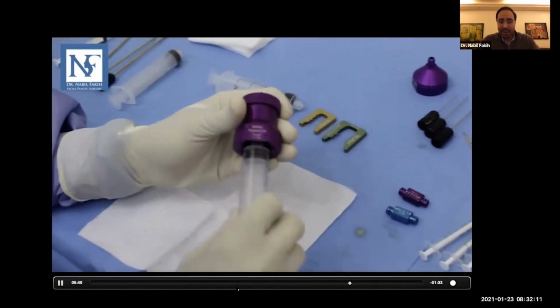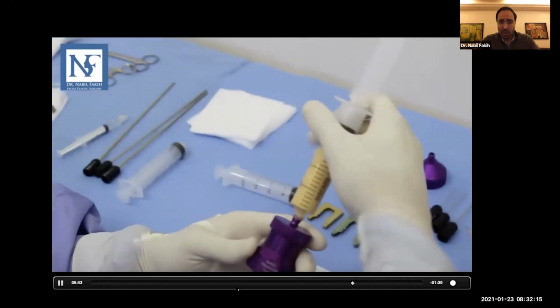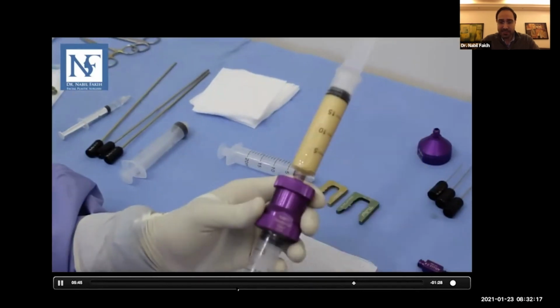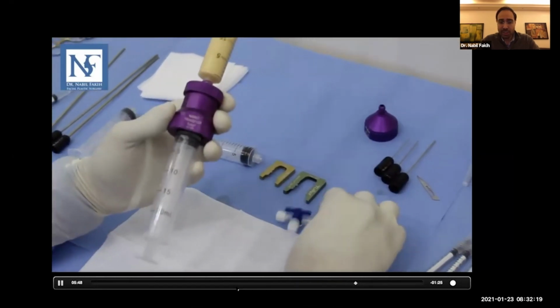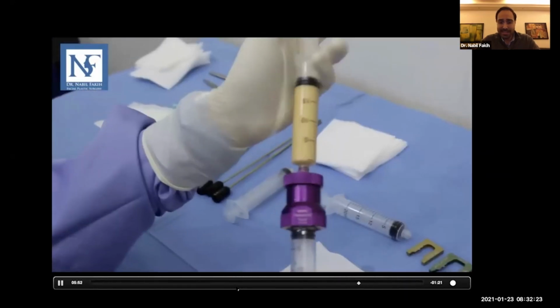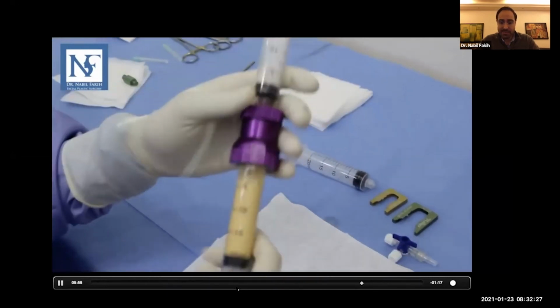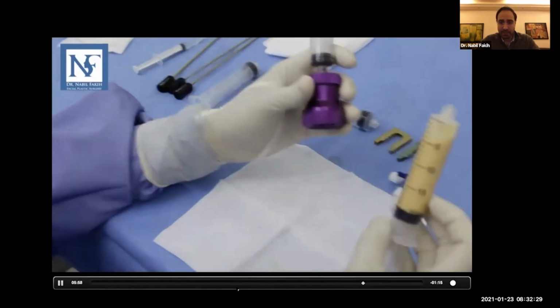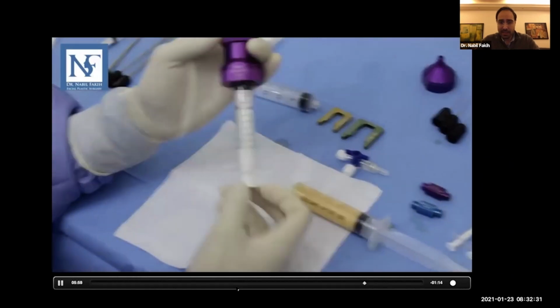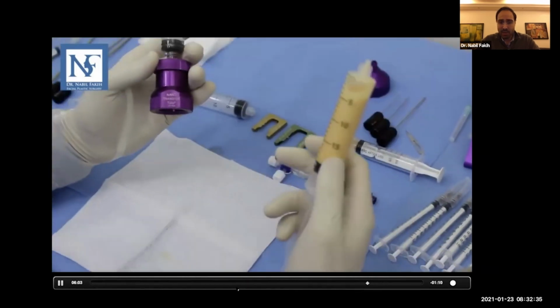So we have a double layer net inside of this transporter, and I will be passing the SNIF, the emulsified fat, to change it to nanofat. If I pass it through this, it will stick all the fat cells in the upper part, and the nanofat, these adipose-derived stem cells, we will have in the lower part. Okay, this is the adipose-derived stem cells. So this is what we call nanofat.